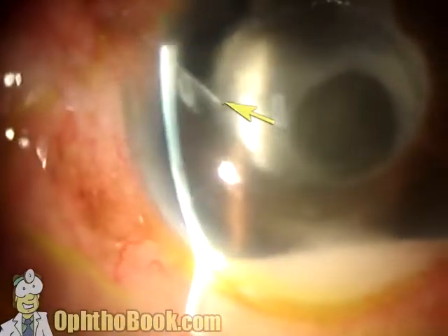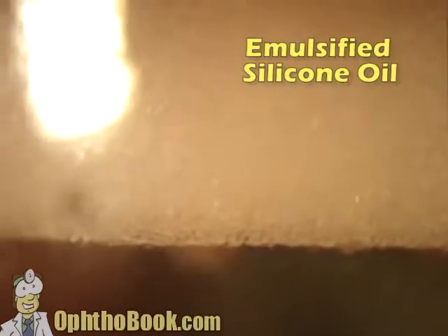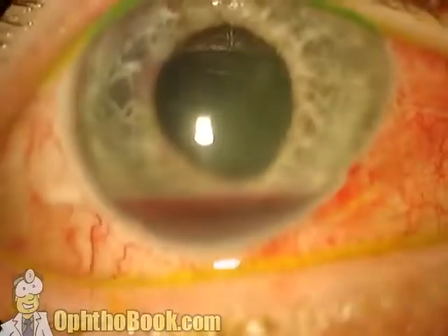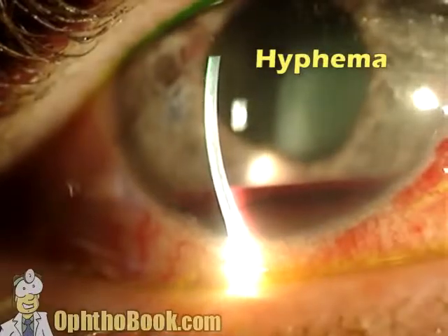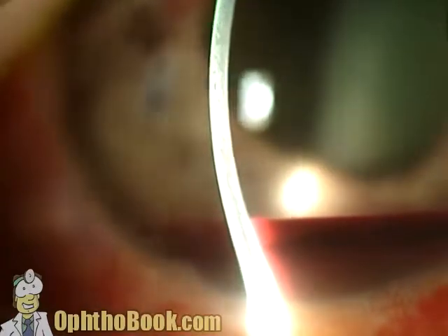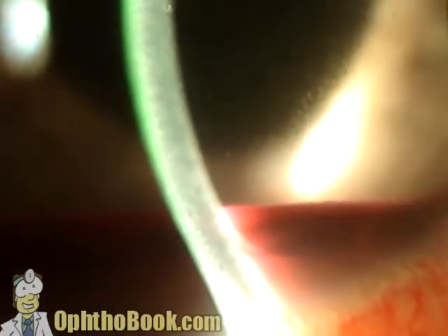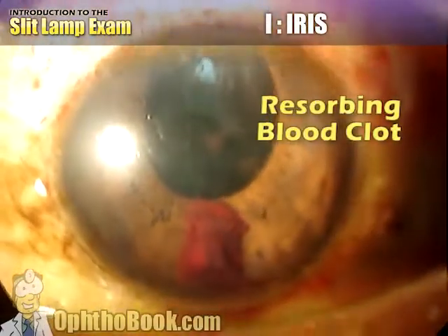Hypopions can be sterile or infectious — this one is probably from an infection related to this tube shunt that went bad. This is emulsified silicone oil: after retinal detachment surgery, silicone burped into the front part of the eye. Silicone is lighter than water, so it floated to the top and created almost an inverse hypopion. Blood is heavier than water, so this hyphema has sunk to the bottom of the anterior chamber. If you look closely you can see two layers of blood — a fresh one on top — and it's plastered right up against the back of the cornea.